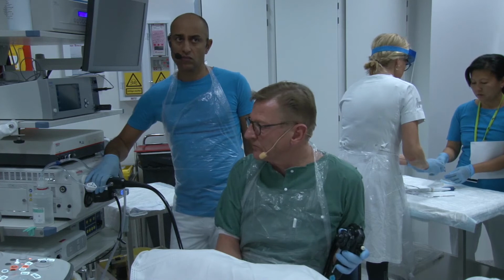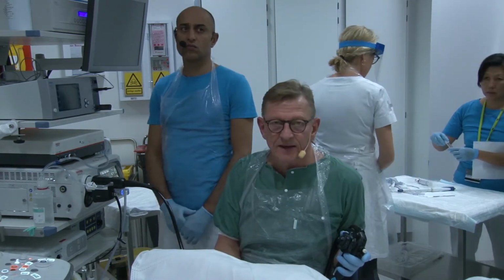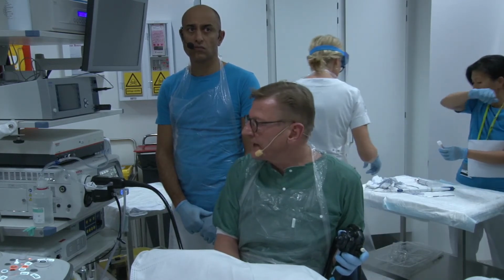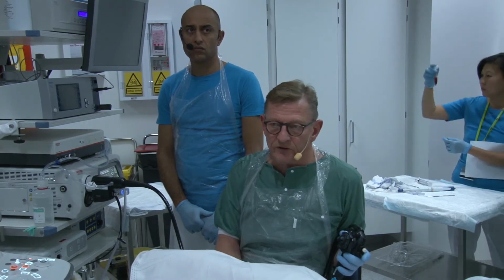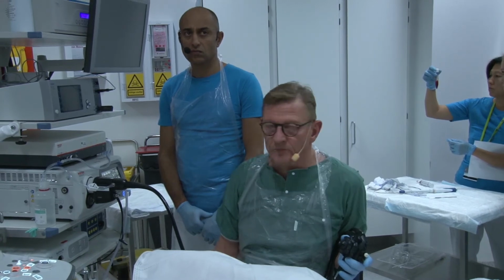That makes it more difficult to get the microbiopsy, as well as in case we want to do NCLE. But I agree, definitely we need studies that show a comparison between these two. But there are some logistical problems based on it.